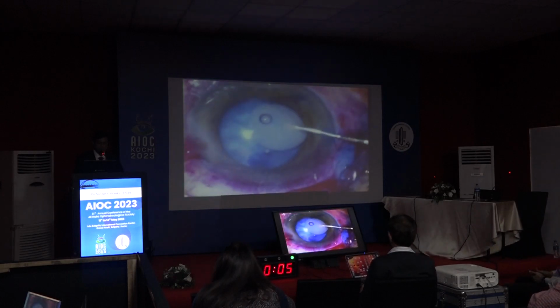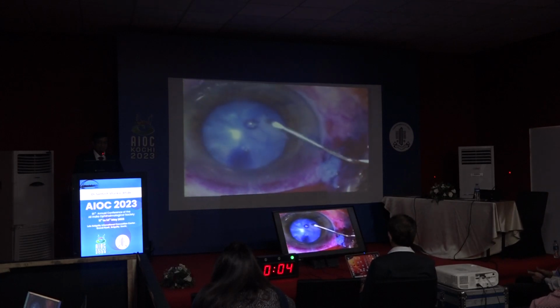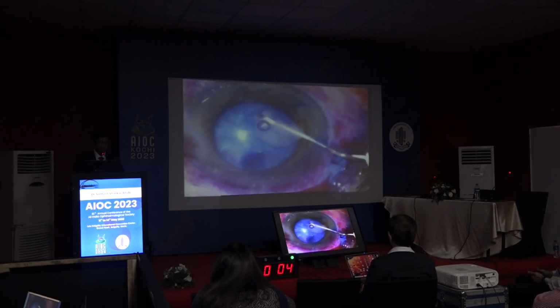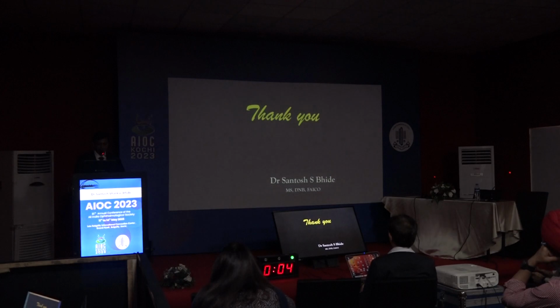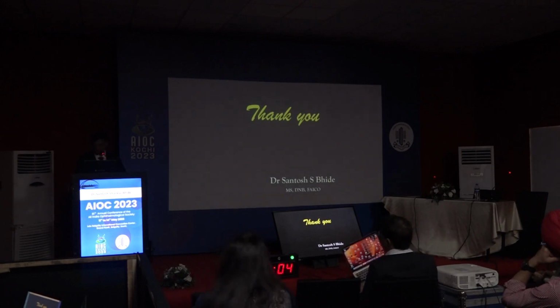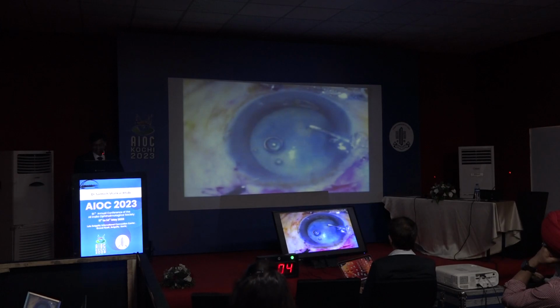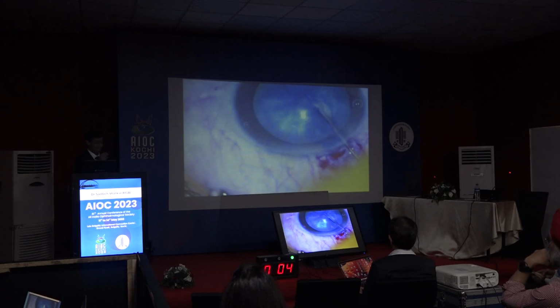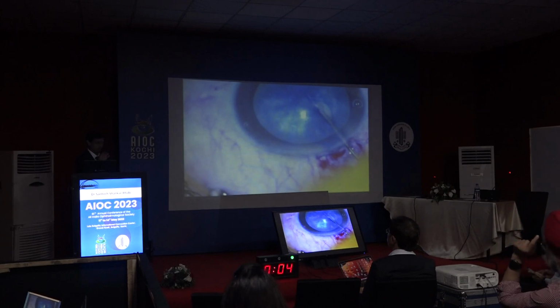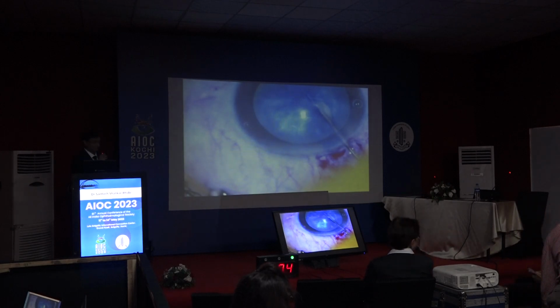Now this is case scenario number 4. There is a lot of milky fluid once you puncture. Now here, oh sorry, I'm sorry. So I have a question for the esteemed faculty: how will you handle such cases? What will be your preferred viscoelastic devices?